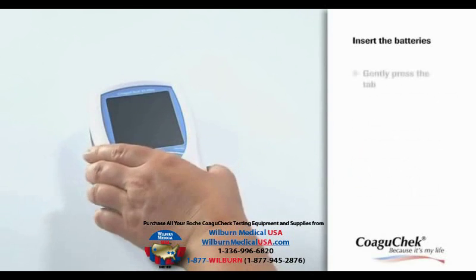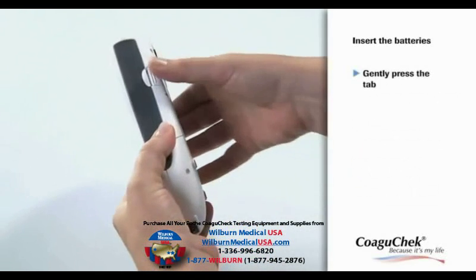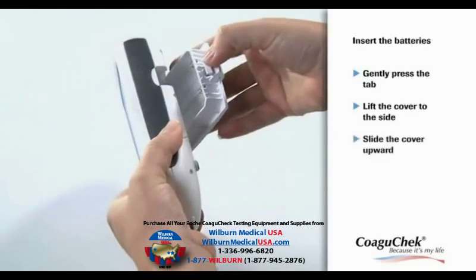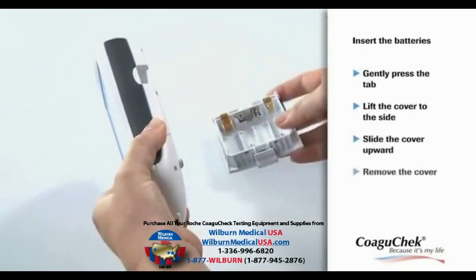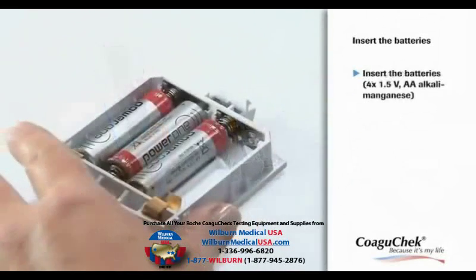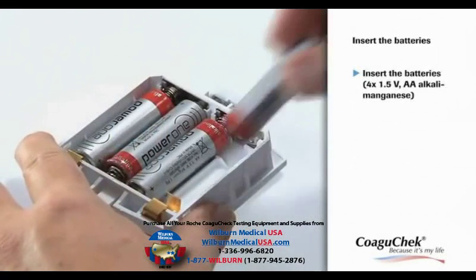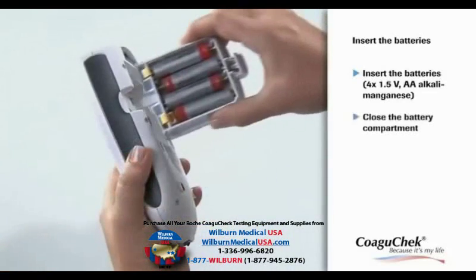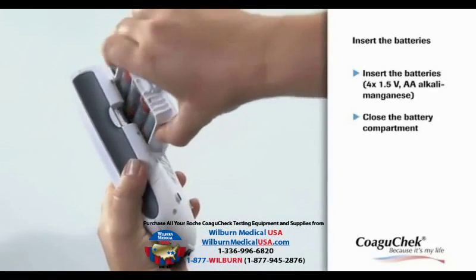To insert the batteries, please gently press the tab on the battery compartment cover and lift the cover to the side. Then slide the battery compartment cover upward and remove it. You can use four 1.5-volt AA-type alkali manganese batteries. After insertion, please close the battery compartment again.